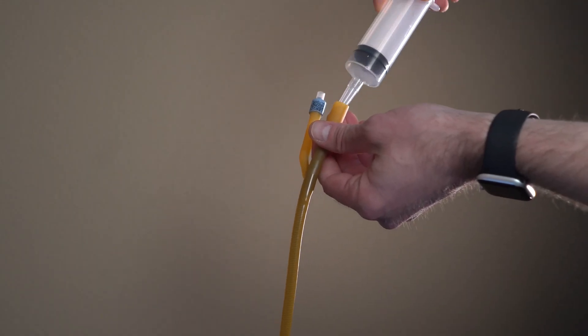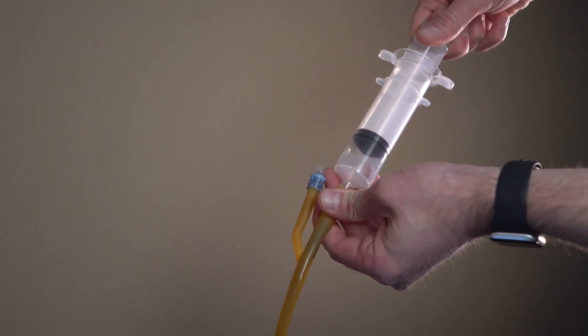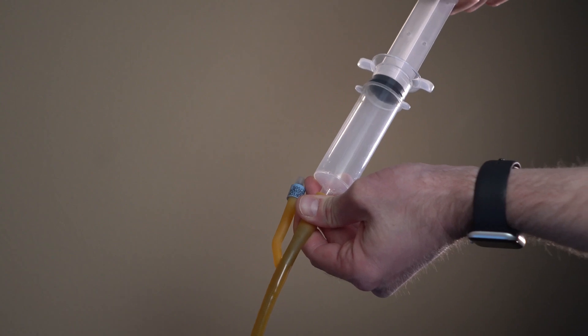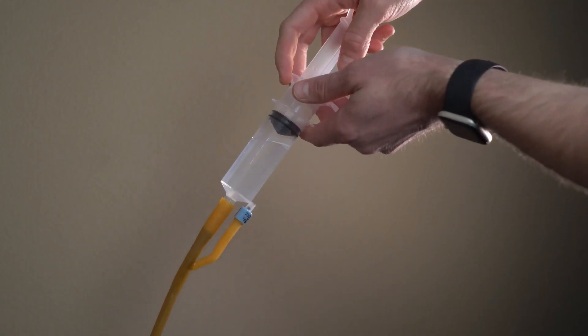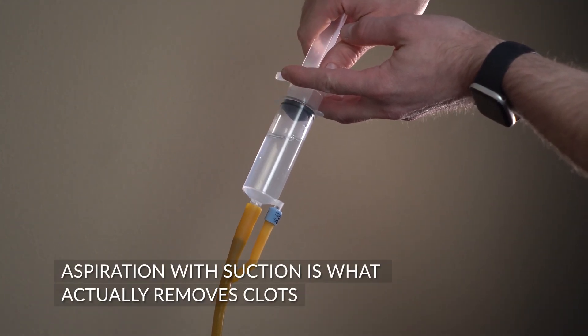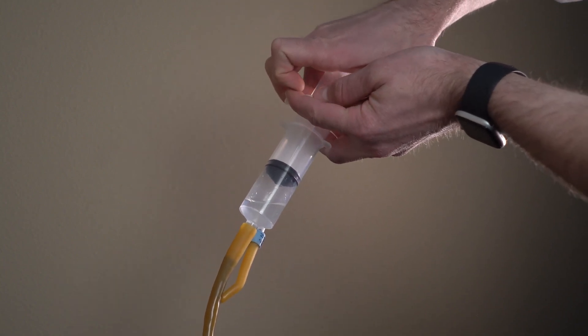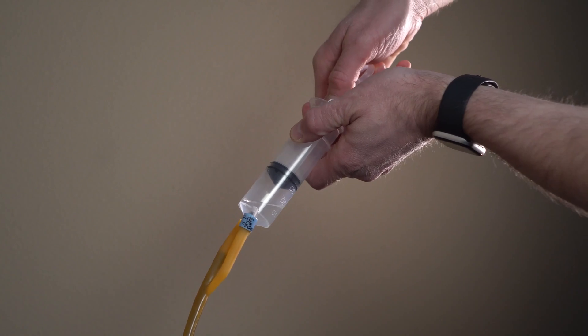When trying to irrigate clots, I usually try to aspirate prior to irrigating any new fluid in the bladder first. If the patient's bladder is completely full at the beginning, additional fluid can be painful or can rupture a full bladder. If aspiration is unsuccessful on first attempt, I try using a single irrigation of 50 to 60 milliliters of saline or water and then aggressively pulling back and aspirating on that fluid to see if you can get a clot out. You can try this again over a few times if you're able to get the amount of fluid out that you put in.